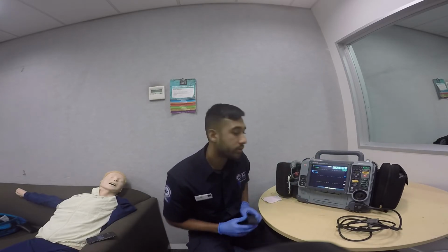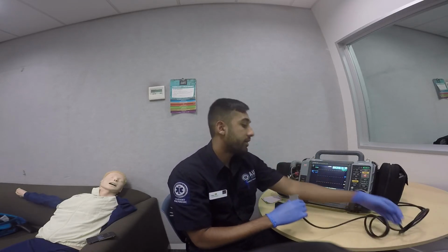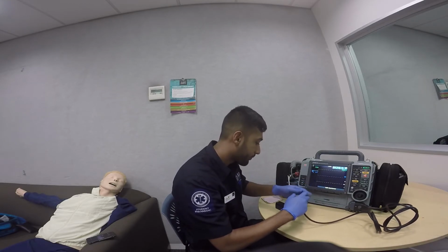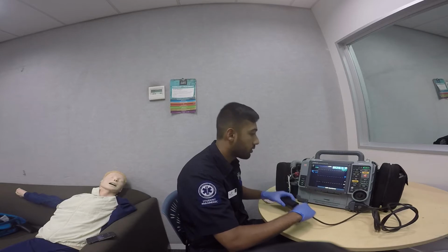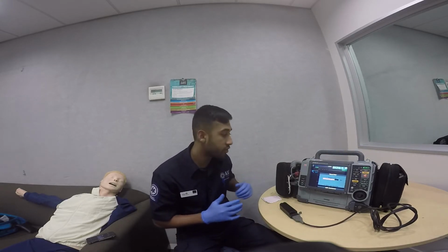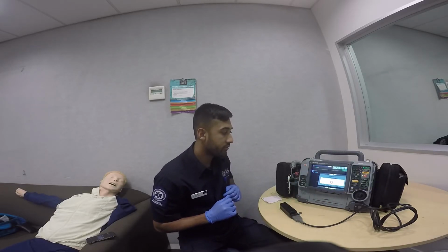So what we'll do is we'll do a test defibrillation. To do that, I'll apply the test probe and we'll hit charge. Be careful because this uses live energy. And shocking now, and shock's delivered.